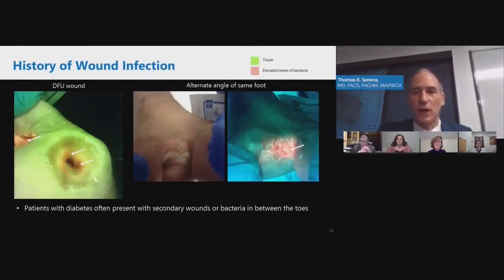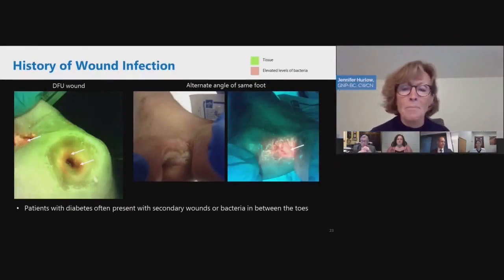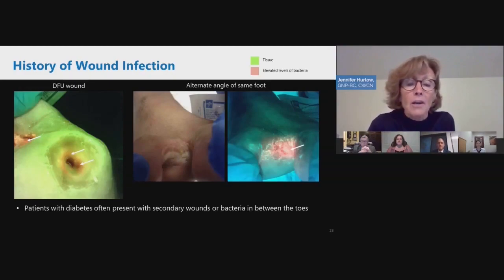Jenny, you've done a lot of work in this area. Thank you very much. This is a picture of the earlier diabetic foot ulcer that I talked about. This is 1 week later. The fluorescent imaging confirms for me that the plan of care was appropriate. There is less red glow in the wound, so the topical antiseptic was an appropriate choice. And the fact that I didn't use antibiotics also, it's clear that it has gotten better without antibiotics, which is critical these days.